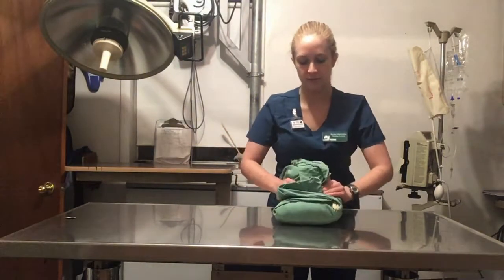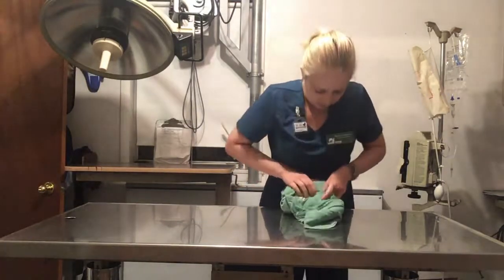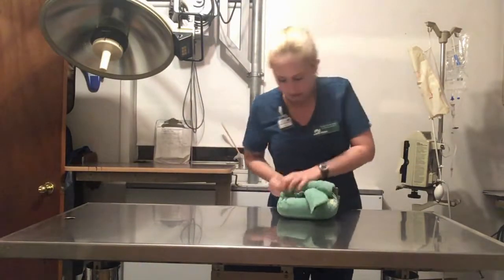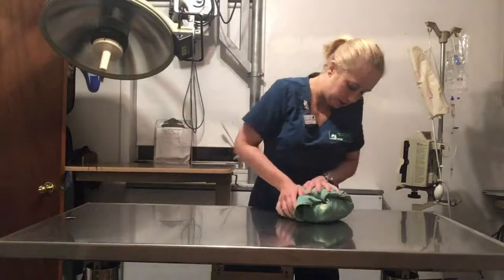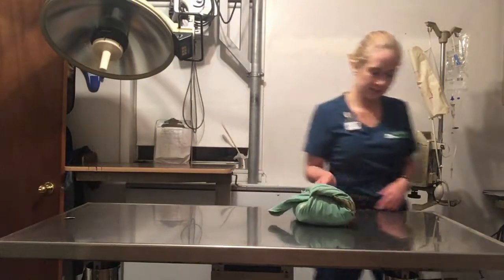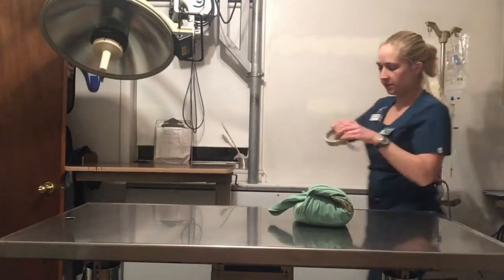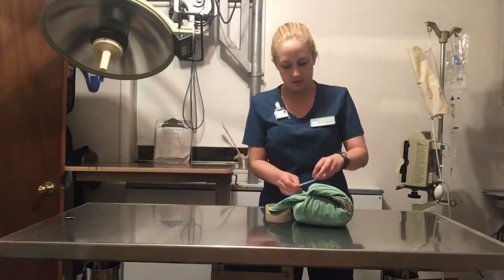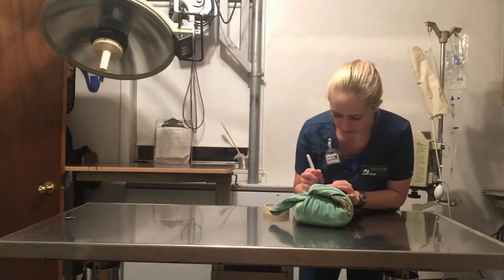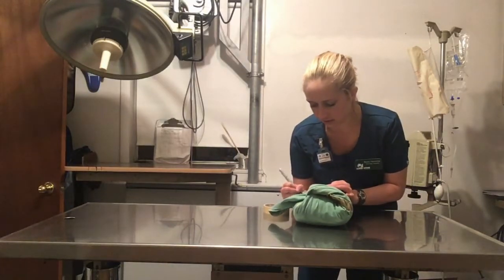It's kind of a big wrap for this. And then you're going to take this, pull it forward, and then just tuck all of that in, leaving out your lip to pull out later. And then I'm going to go ahead and take my steam indicator tape again, place it on there, and then with the Sharpie I'm going to label that gown, today's date, and my initials.